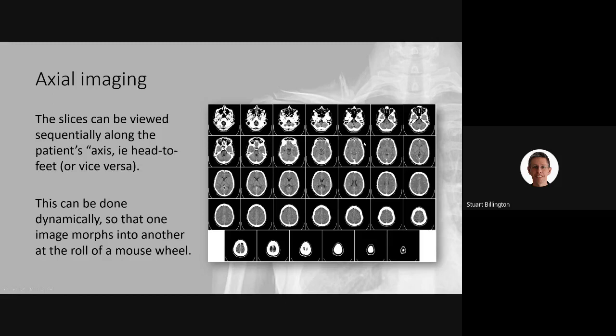And then you can just about start to see the cavities within the front of the skull. Here's the eyes starting to appear, a little bit of the nasal cavity. Here's the eyeballs. As we pass through, you can see the nose gets bigger and bigger and bigger. And then we pass through the eyeballs now. So I guess these are sinus cavities. And then this was as much as needed to be imaged for this patient. We've run out of brain by this point, and you can just see that there's, I guess, the top of the brainstem heading off down the spine. So it is amazing, the technology.